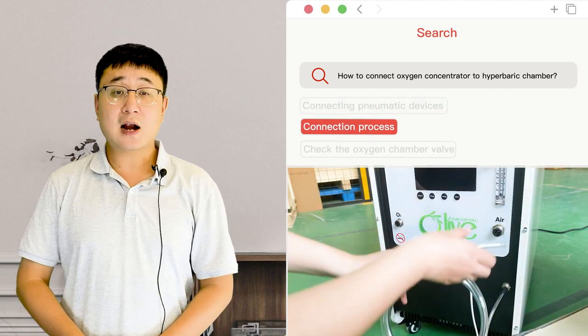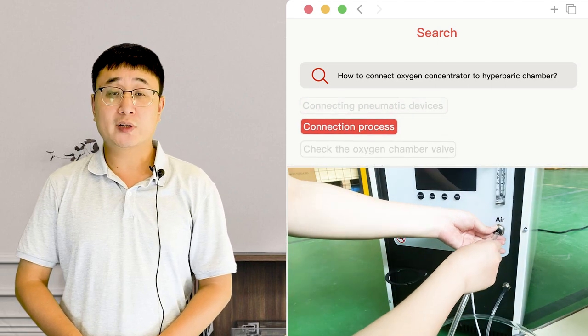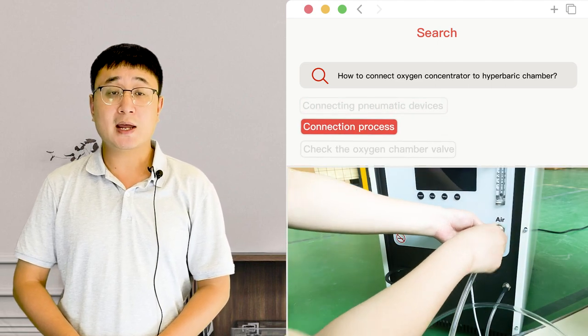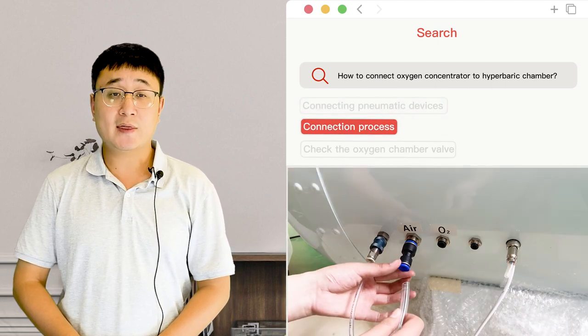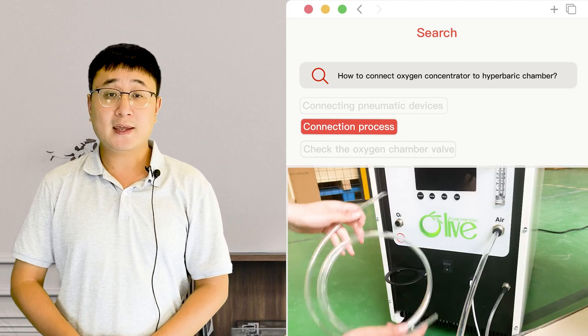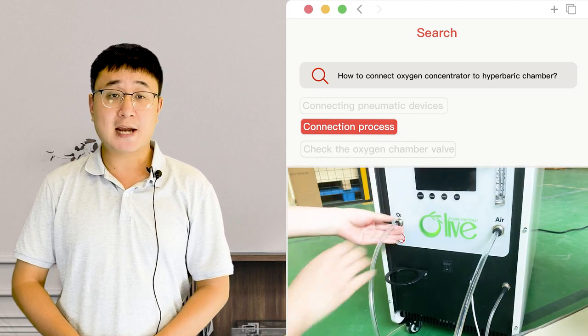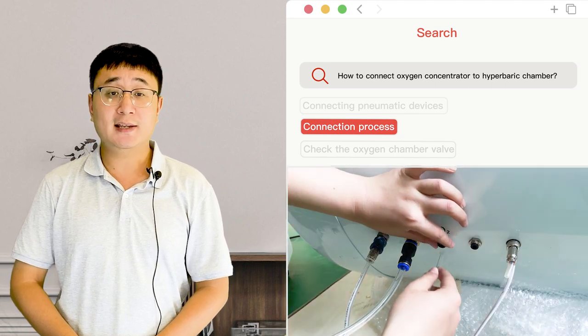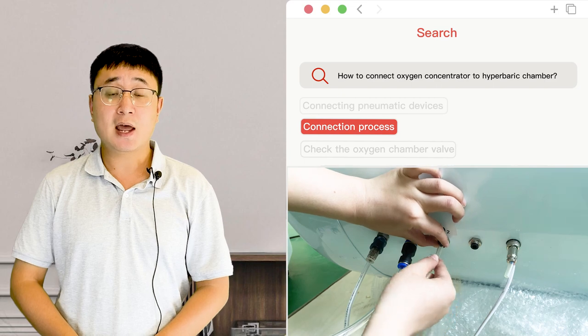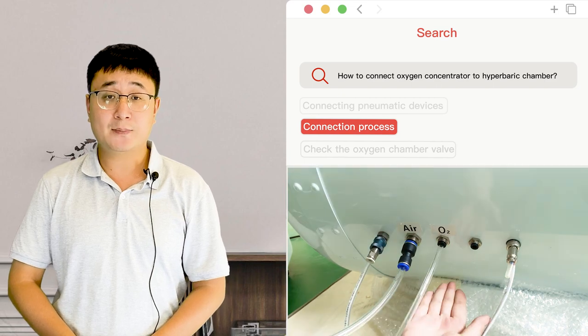Connect the air outlet and oxygen chamber air inlet with an air pipe. Connect the oxygen outlet and oxygen chamber oxygen inlet with an oxygen pipe.